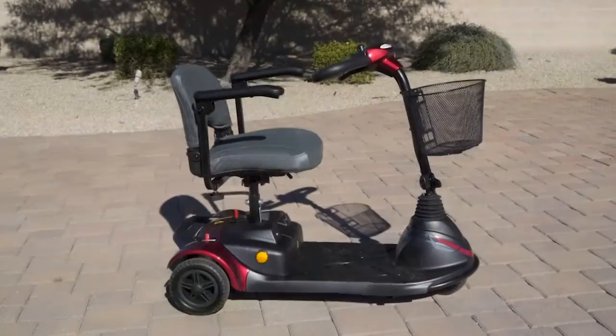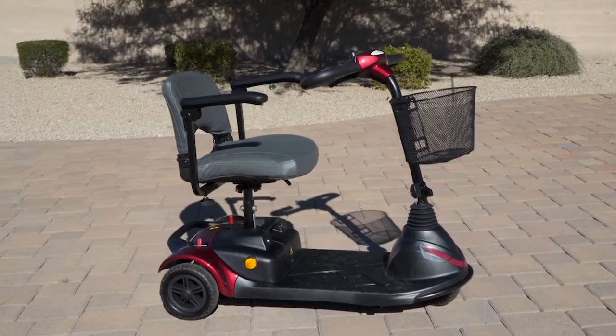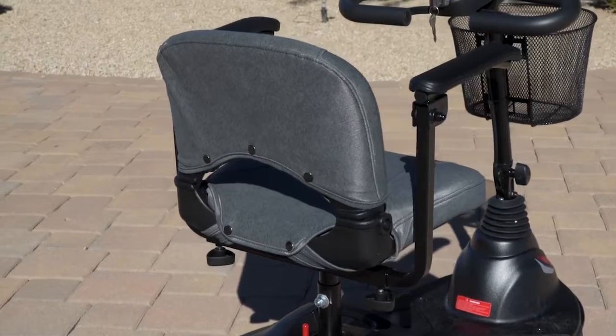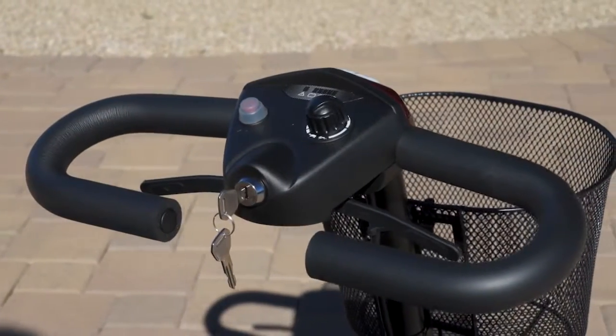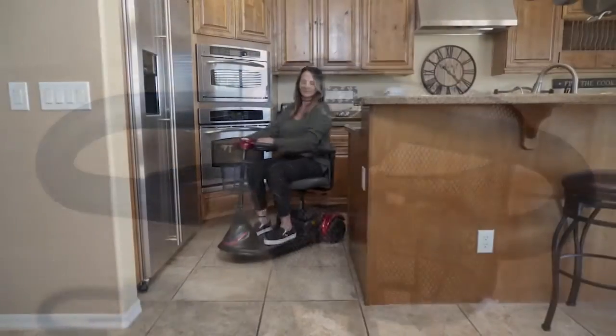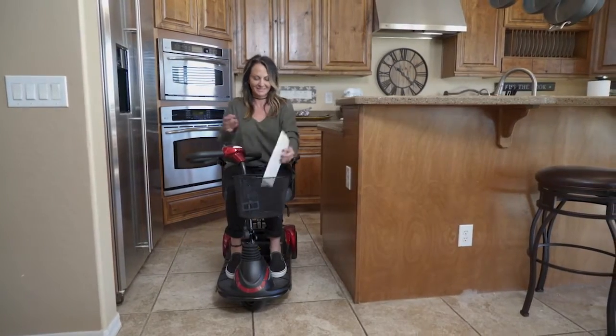The EWM40 has a 300-pound weight capacity to suit virtually any rider and features a non-slip platform and a swivel executive seat that has a convenient snap-on seat cover for easy cleaning. You'll also find easy-to-use controls on the Delta Tiller that makes it easy to ride. And with a 9-mile operating range, the EWM40 will keep you going all day.